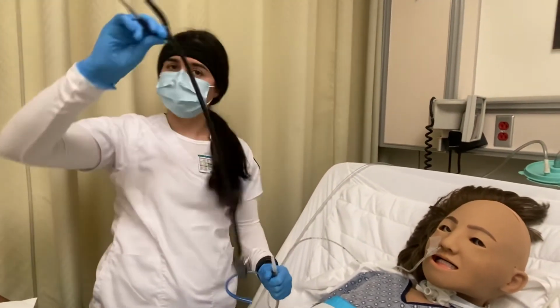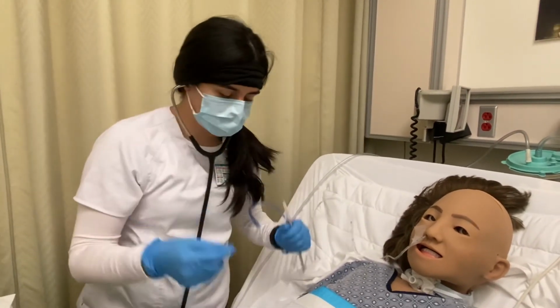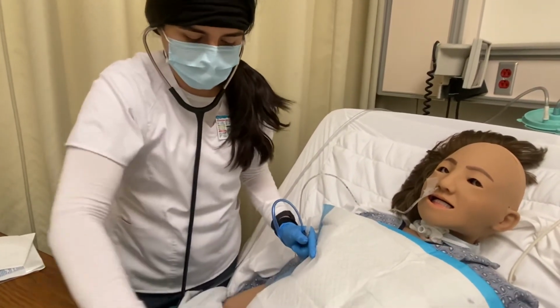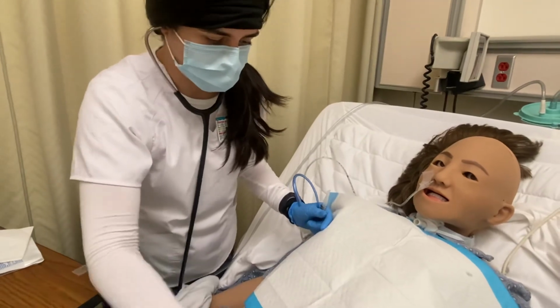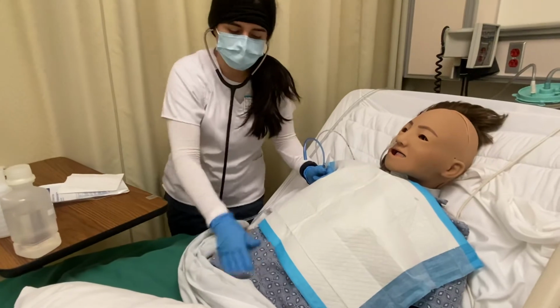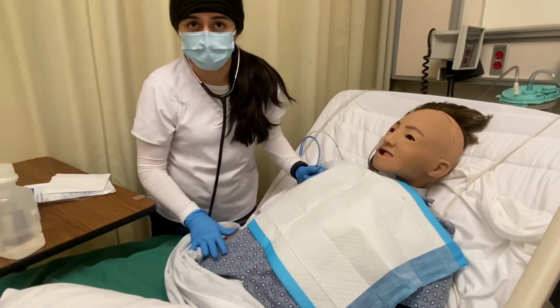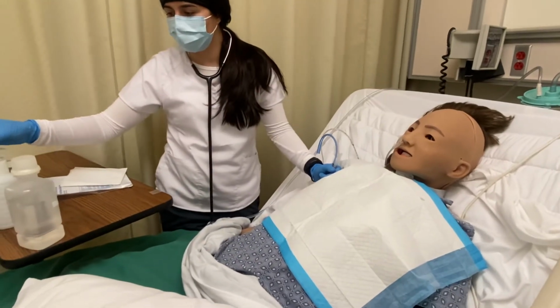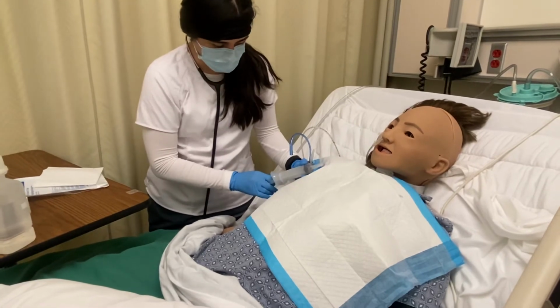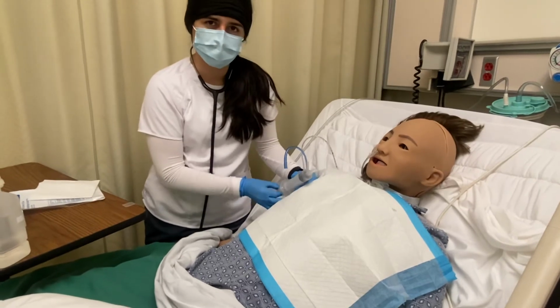Once it's secure, I could let go. On this one, I would put this stethoscope on. Would you really? No. That's gross. And I would put this down. It's still in the plastic. That doesn't matter. I would listen to the abdomen, I would have their abdomen exposed. I would get the syringe. It should be maybe around 30 ml.